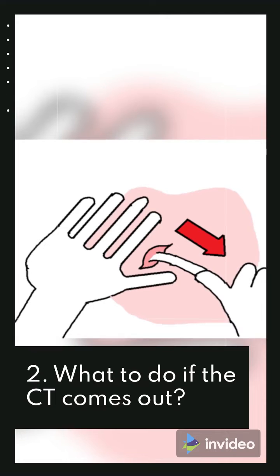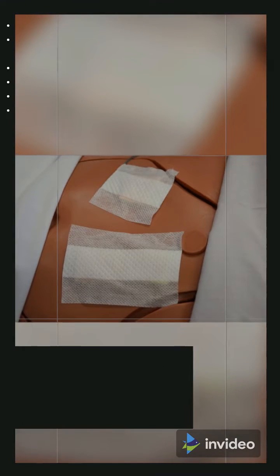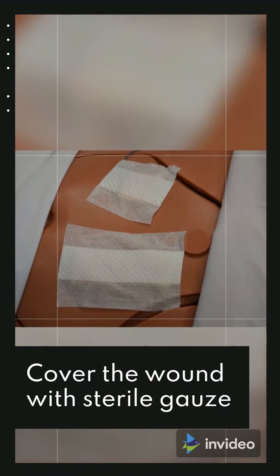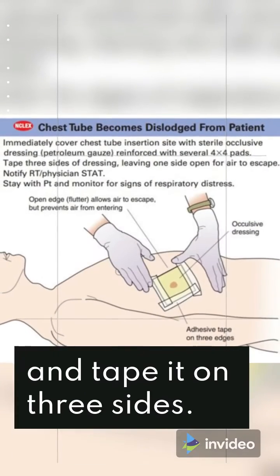What to do if the CT comes out? Cover the wound with sterile gauze and tape it on three sides. Only on three sides to avoid air trapping into the lungs.